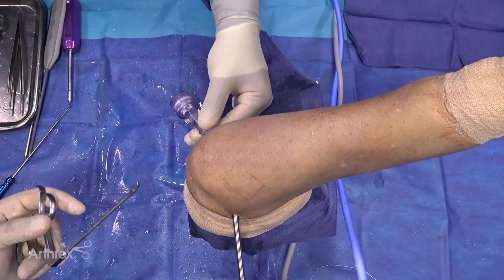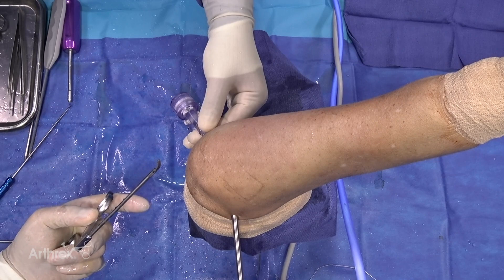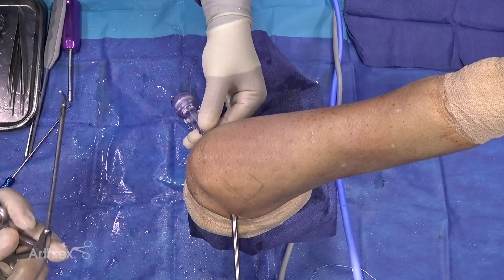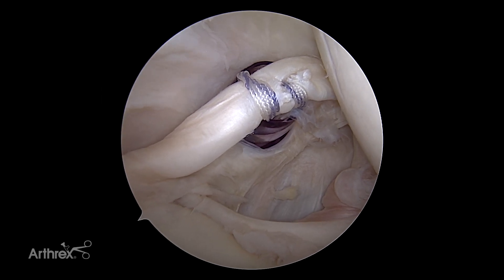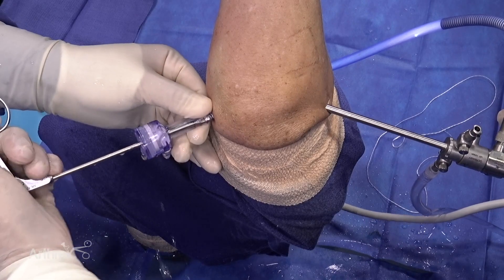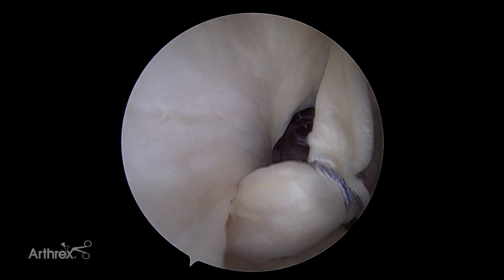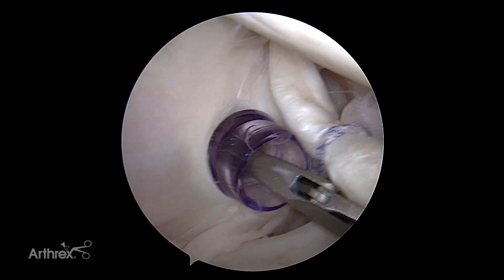At this stage you can use these curved cutters, which are available in both left and right. One of the great advantages of this is it allows you to cut the biceps while staying away from the tip of your suture. One of the key ways that this knot can fail is if you cut the biceps too close to the suture — the looped end, the luggage tag end, can actually slip over the top of the biceps. So you want to make sure that you leave yourself enough biceps stump so that does not happen. At this stage I'm going to go ahead and cut this biceps as close to the top of the superior labrum as possible, with the top end of the scissor over the top of the biceps to make sure that you are not cutting any other tissue.